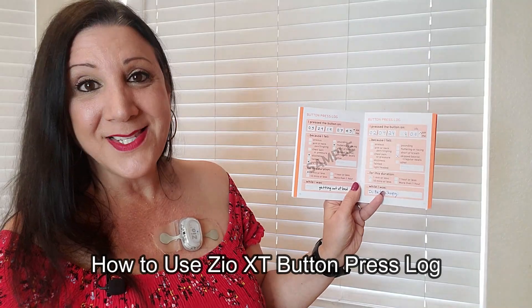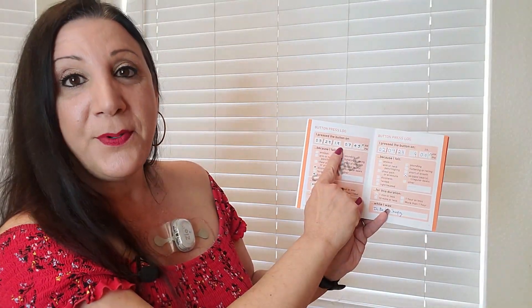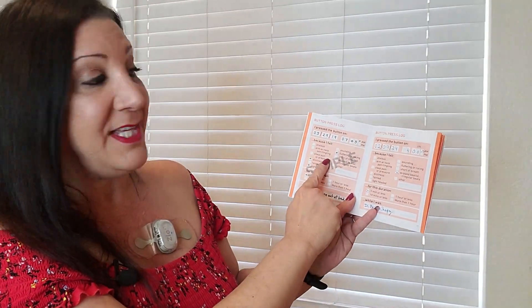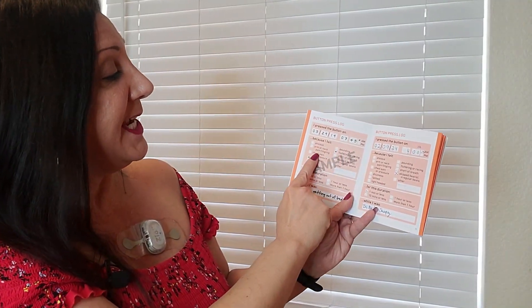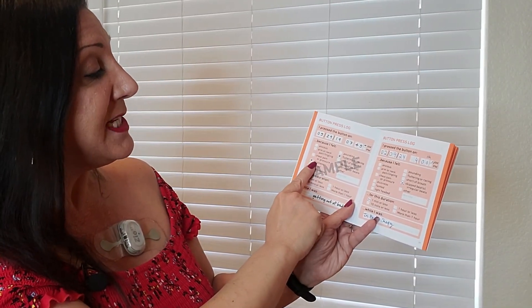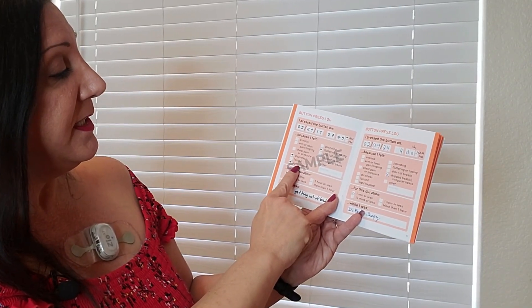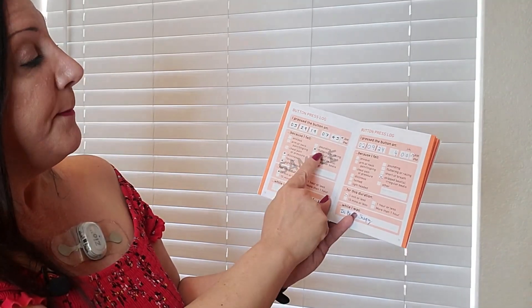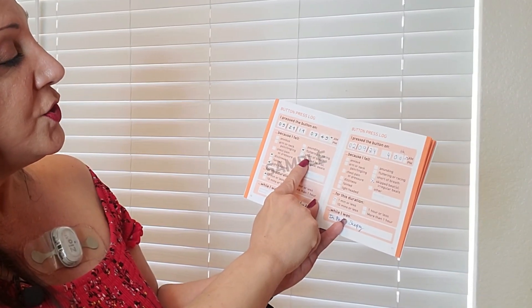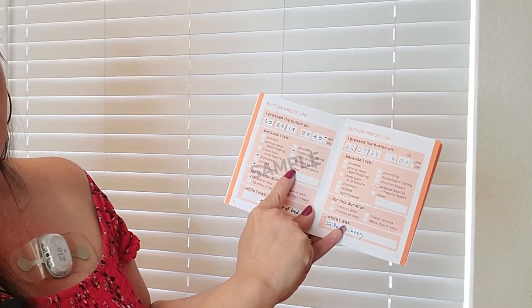Here's how to use the button press log. When you press the button, you record the date and time and check mark one of the following symptoms: felt anxious, arm or neck pain, tingling, chest pain or pressure, dizziness, fainted, lightheaded, pounding, fluttering, racing, shortness of breath, skipped beats or irregular beats, or other.